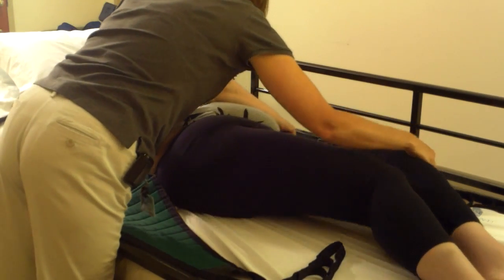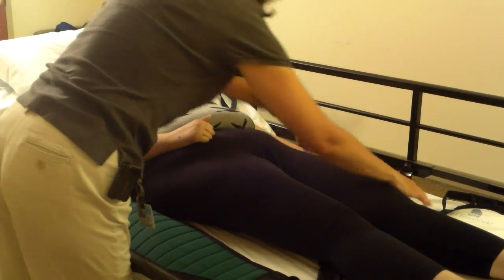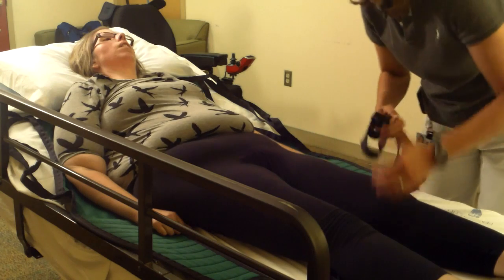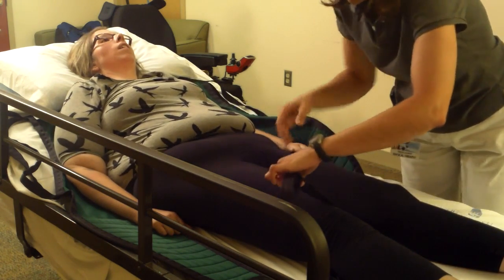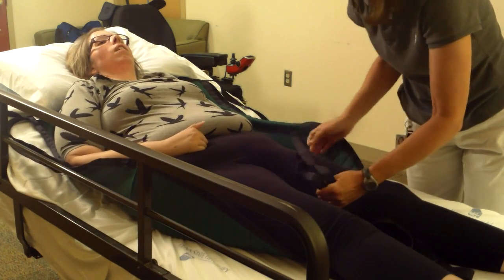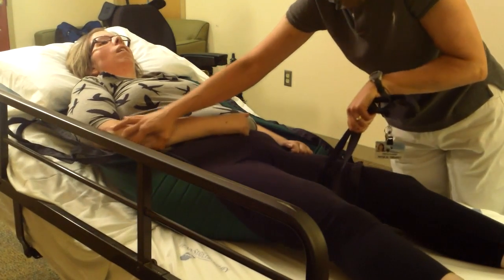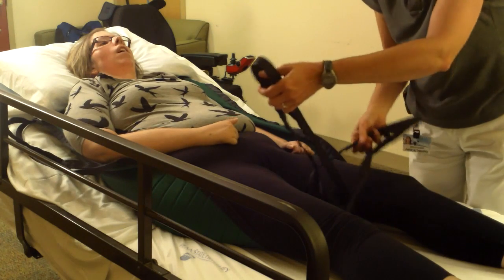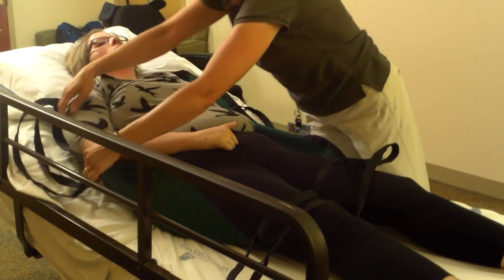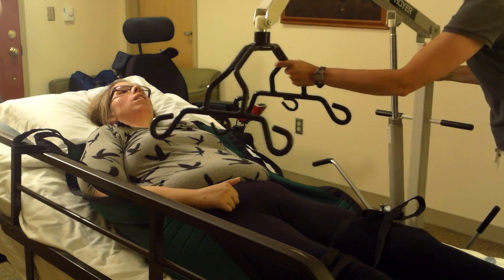And have the patient positioned correctly over the sling. Remember to tuck the leg pieces underneath each leg. And again, make sure you cross the loops so that the leg pieces are crossed over. Make sure the upper loops are properly positioned.